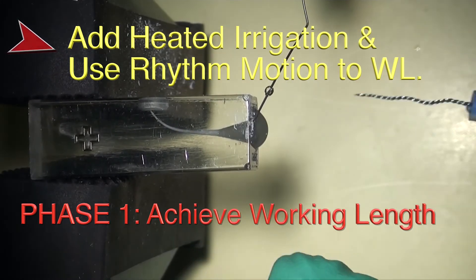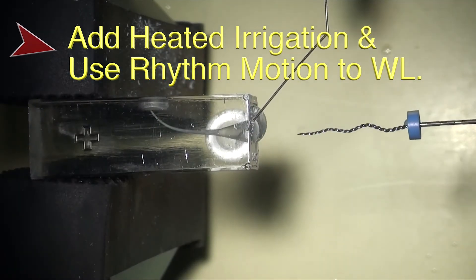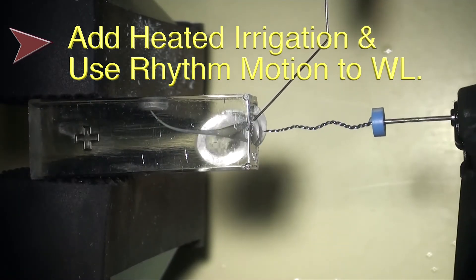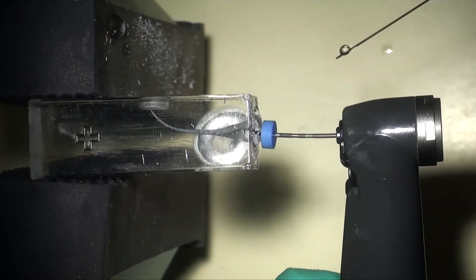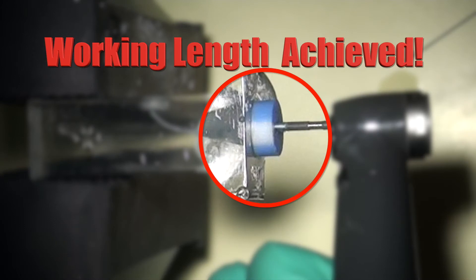The idea is to subset the shaping into two phases. First, we get to length using a general rhythm motion of three long strokes. If you don't reach working length in three strokes, repeat. It typically takes two passes of three strokes to reach working length in tight canals.